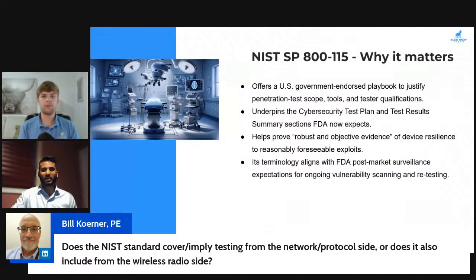So depending on the severity and the level of risk that comes out of these findings in penetration testing, most of the time the recommendation is obviously to remediate. In some cases, you can justify it if it's non-applicable, or how it might not interact at the same level of risk that was perceived during the testing. But ultimately, this is a direct source into your risk management process. You need to mitigate it, and after remediation you go into retesting, do a penetration test again to ensure that you've effectively eliminated it or mitigated it to the lowest level possible in terms of cybersecurity risk and threat.